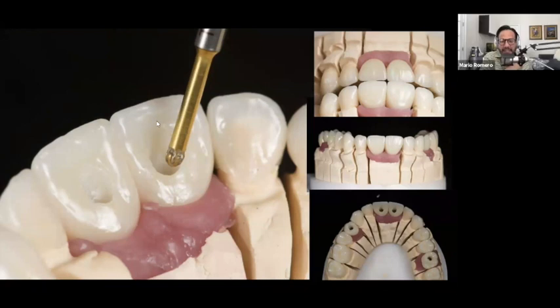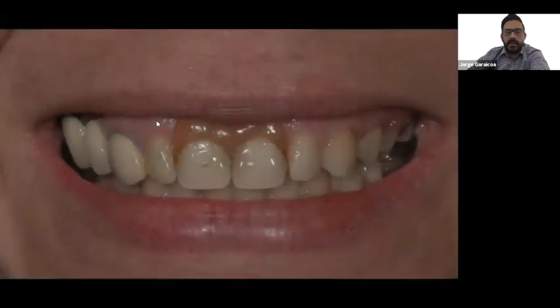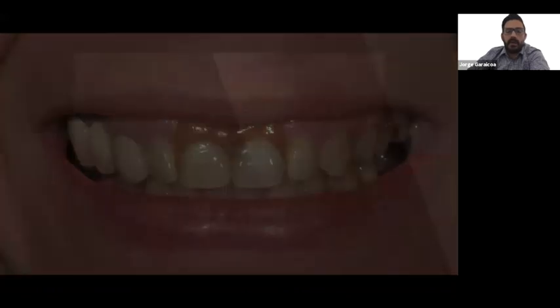And I think this is the case that you're showing right now. I saw those implants; they seem to be fairly well placed in a good longitudinal axis. So this is more about you gaining more thickness of your material, and that's why you decided in this particular case to use your angled screw channel. Correct. Exactly.